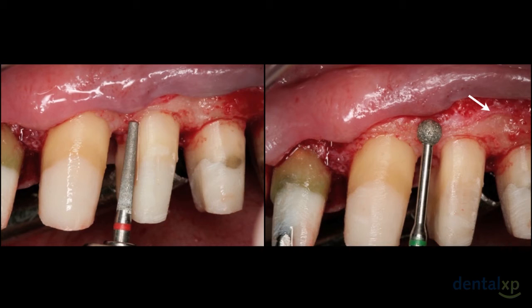This burr is a C801L, again from Axis Burr Company, and the phone number is 1-800-355-5063. Let me clarify, I don't care where you get your burrs from as long as they are similar to these burrs, and in particular they are not chamfer burrs. Chamfer burrs would ditch the margins of the bone if they were used properly. You can go back to the video on furcation treatment, and I show you the different burrs and the reasons we only want to use an end cutting burr.